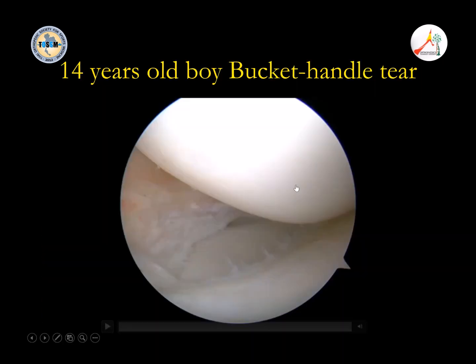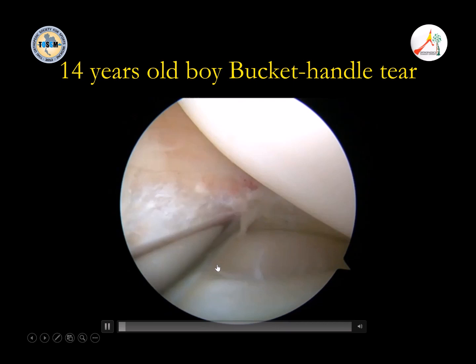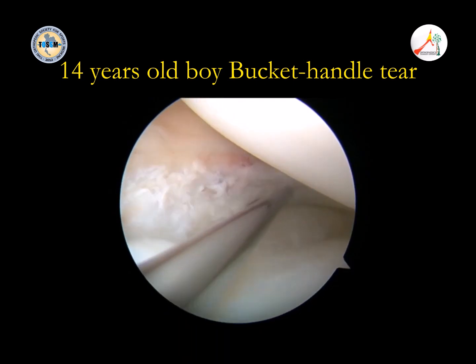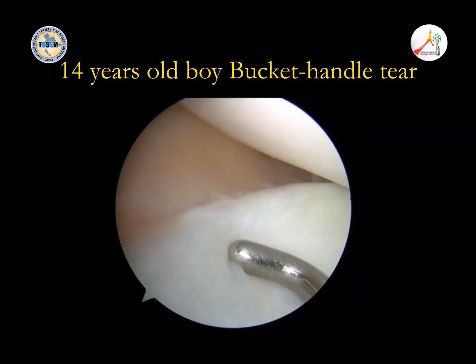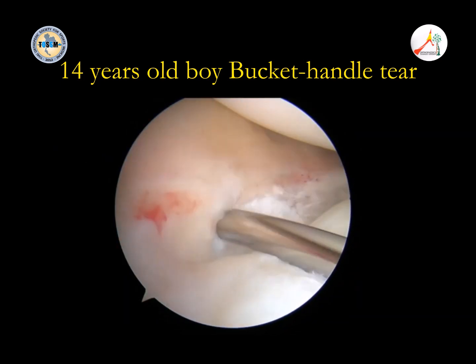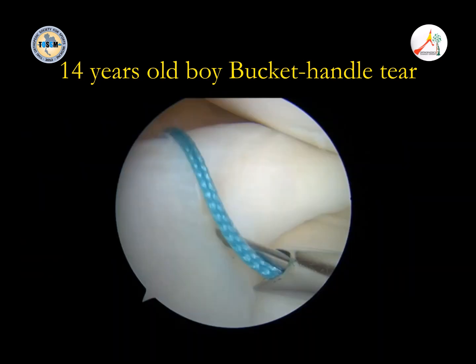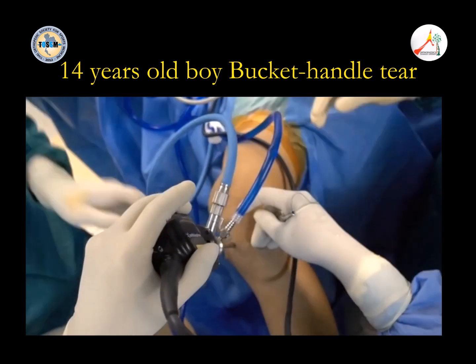This is a 14-year-old boy. He has a bucket handle tear of the meniscus. He is only 14 and wants to be a professional football player. So this is his bucket handle meniscus. First you need to make it fresh with a shaver and trephination, and then repair the meniscus. We start from the anterior part first.